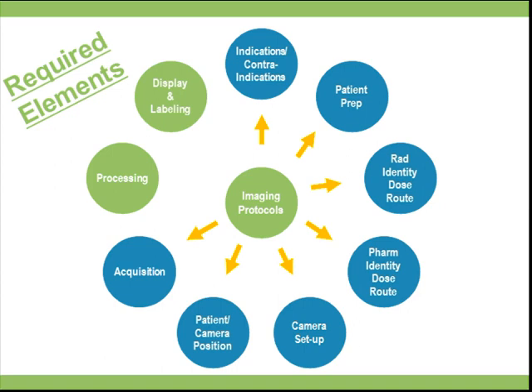The camera computer-specific acquisition instructions, including the views, timing of the views, counts per view, or number of views, as well as PET-specific parameters, pre-filtering or reconstruction, and if applicable, attenuation correction must be stated. These parameters must be in adherence to the American Society of Nuclear Cardiology or the Society of Nuclear Medicine and Molecular Imaging's published guidelines. Camera computer-specific processing protocols, including instructions such as filtering, reconstruction parameters, reconstruction algorithms, attenuation correction, motion correction, curve generation, region of interest placement, reformatting or reorientation, and quantitative analysis requirements must be listed.